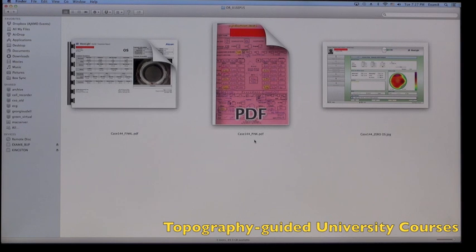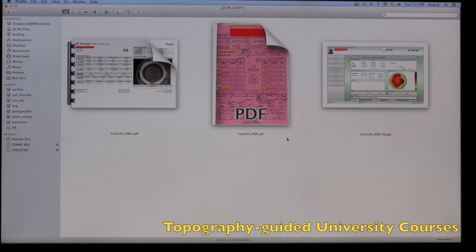And then other data such as pupilometry, minimum cornea thickness, and what our clinical refraction of treatment would be in the boxes in the bottom.